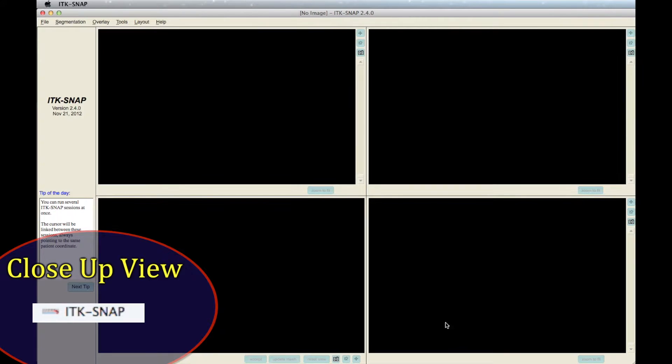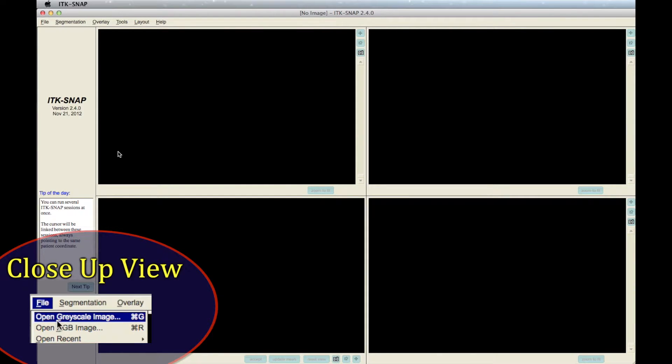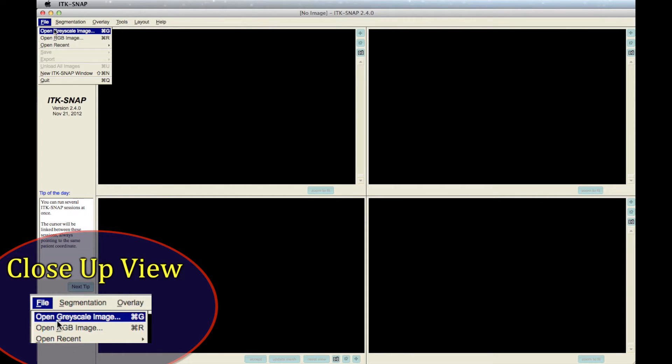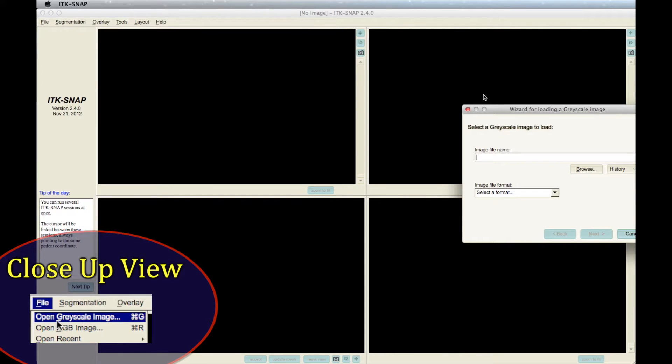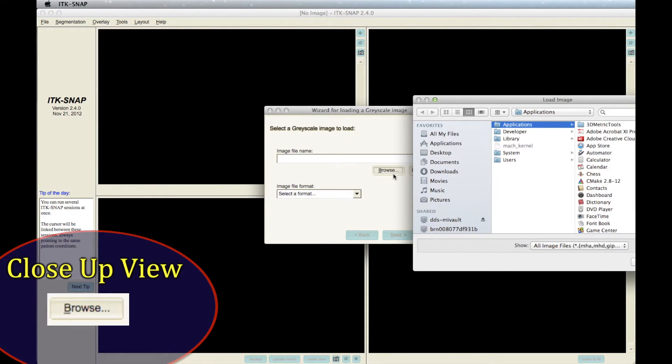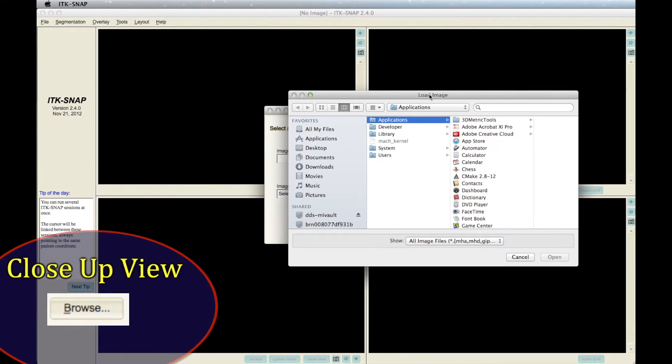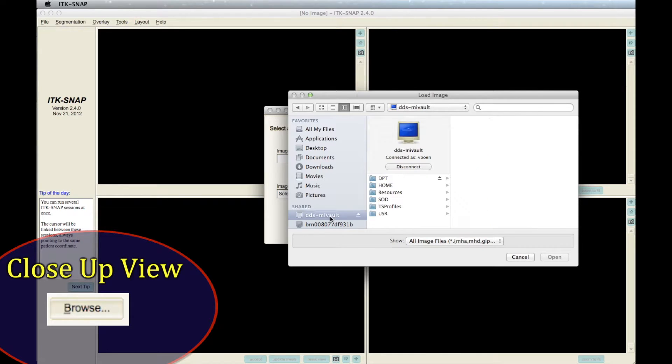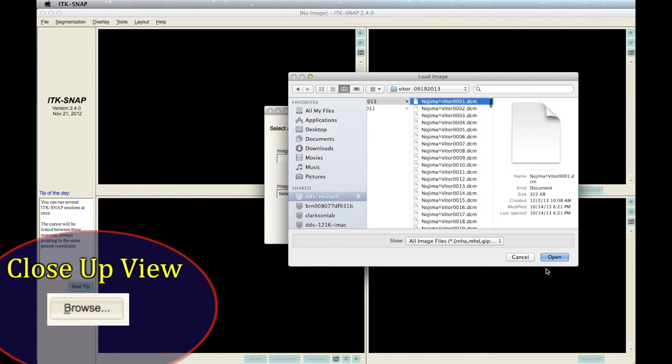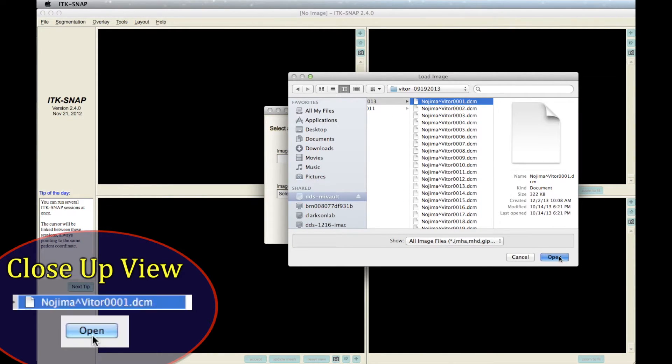To load a DICOM image, go to File and then Open Grayscale Image. Browse for your file. Select the DICOM file and hit Open.